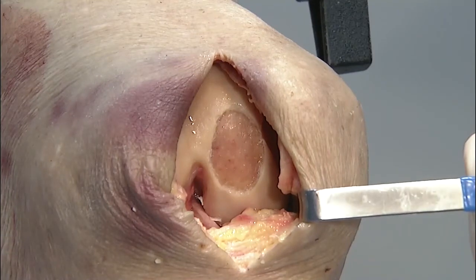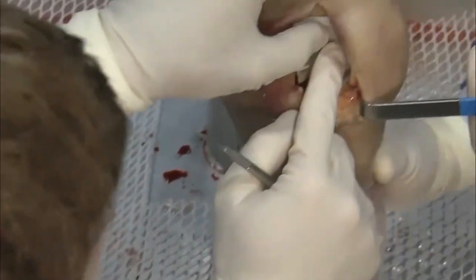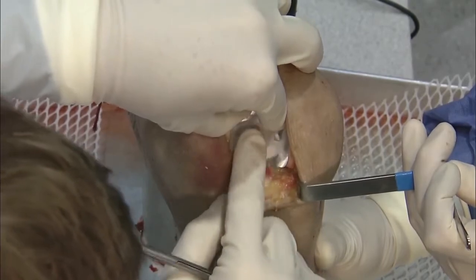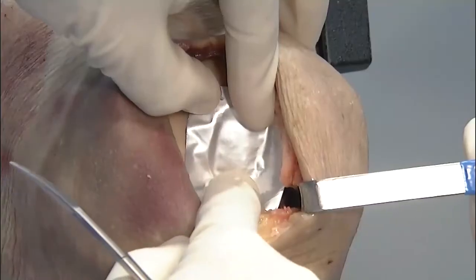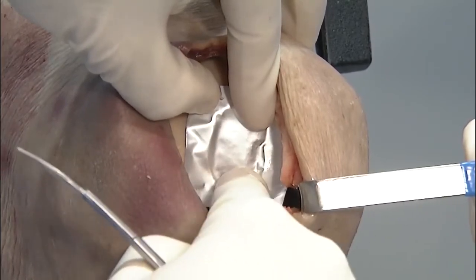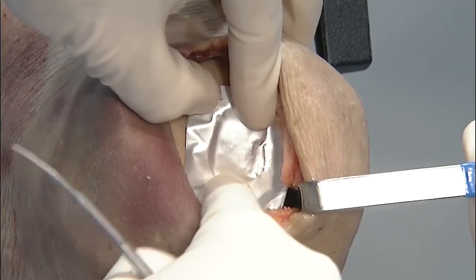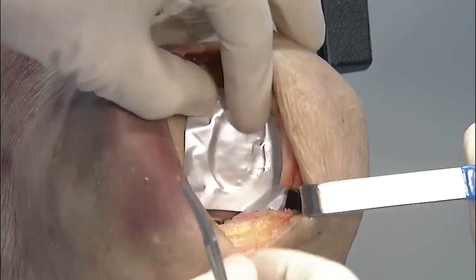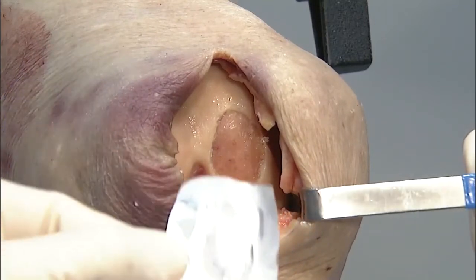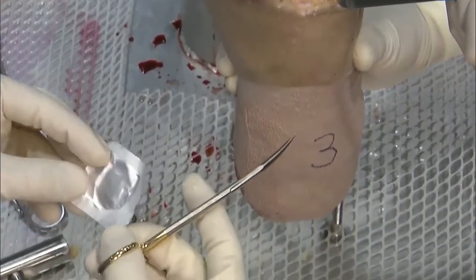You want to make sure that your foil template is very precise, because you don't want your graft hanging over the edge. So what I'll typically do is start by pressing, and this foil is nice because it has memory, so it really indents well. I don't know if you can appreciate that. But now you have your shape. Yeah, we saw it pretty good in the joint itself. Yeah, we can see it there.